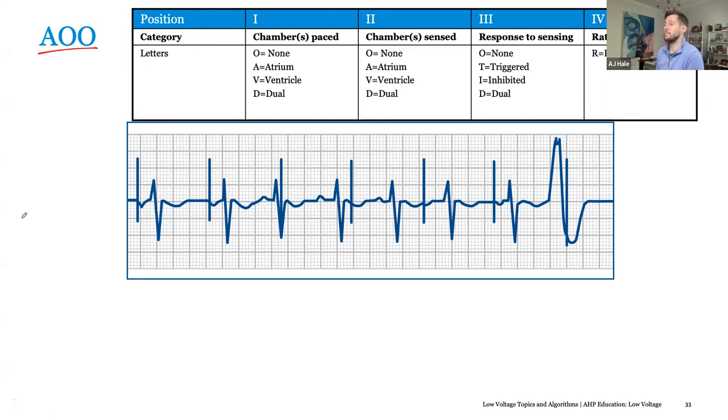Okay, we're good. The only advantage of an atrial only device may be if they just have some degree of sinus brady or sick sinus syndrome, and they can get support without worrying about occlusion. It's a simpler device, it's cheaper. Down the road, you stick a bunch of leads in there and they're more likely to develop occlusion. You can get SVC syndrome, or it could be harder to extract if they get an infection. So the argument can be made it's cheaper and easier just to put in an atrial only lead.